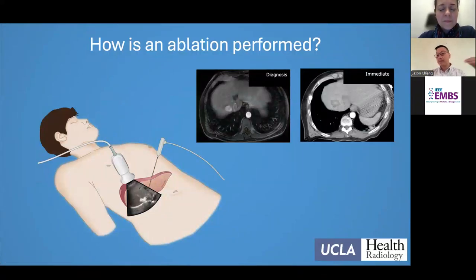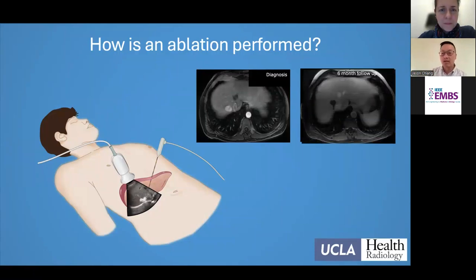After therapy, they go home, and they come back to me every 3 months. We get an MRI scan, and you can see here this hypo-intense structure showing the post-ablation changes. Again, there's no more enhancing components here. And so this is called a complete response by ablation. And so these patients do very well.